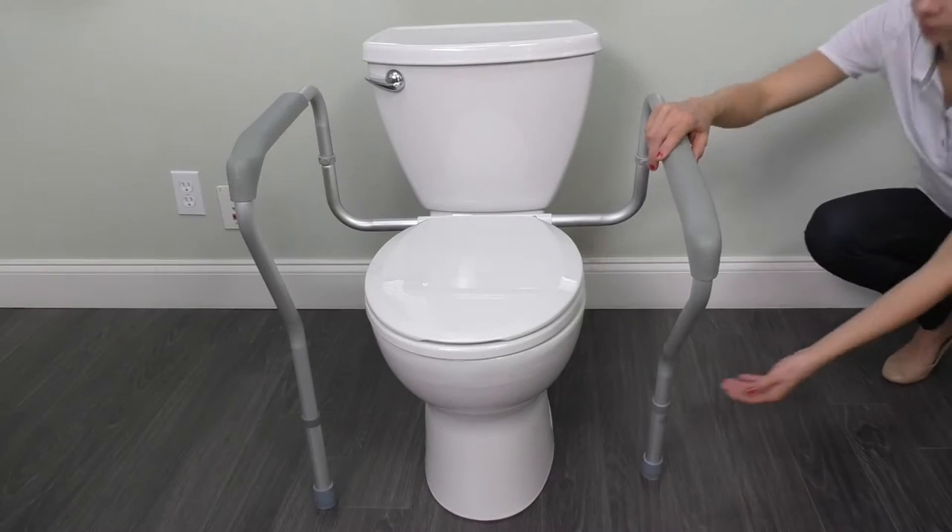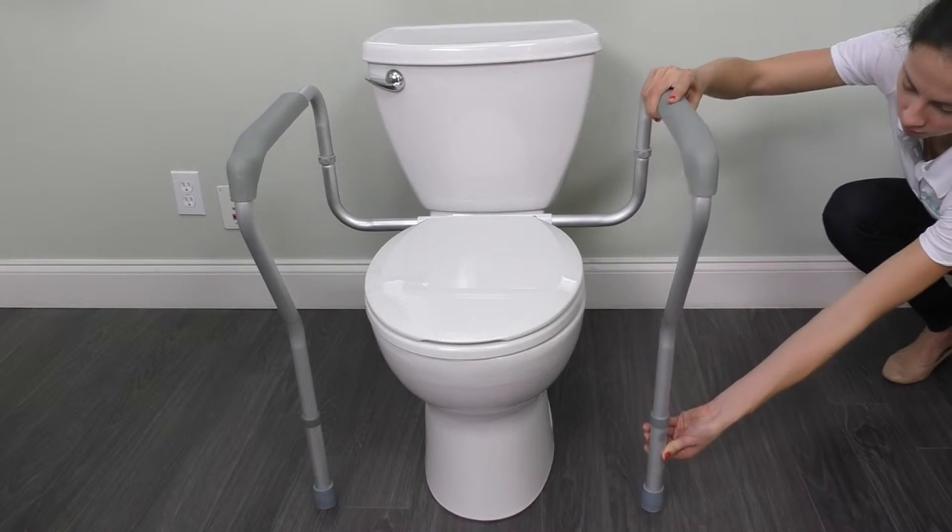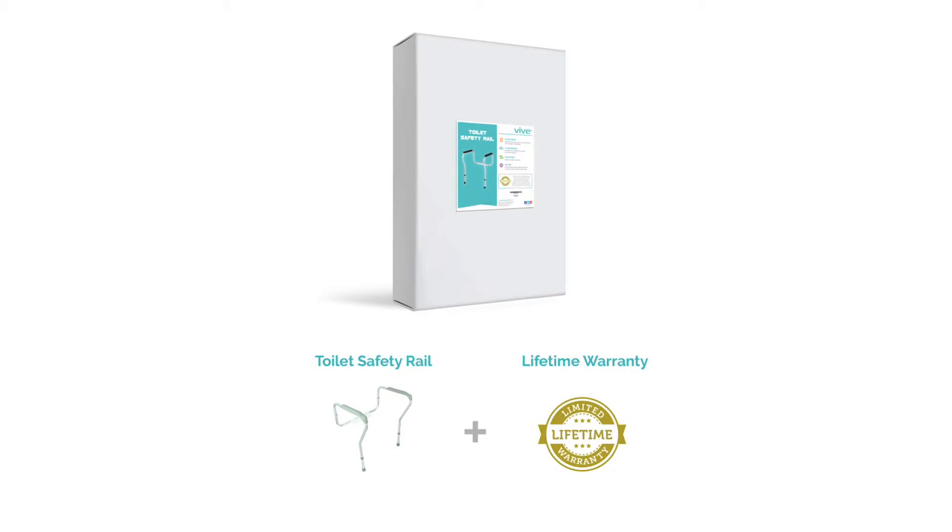Its armrests are padded for comfort and it is easily adjusted to accommodate a range of heights. Built to support up to 300 pounds, it's protected by a lifetime guarantee.